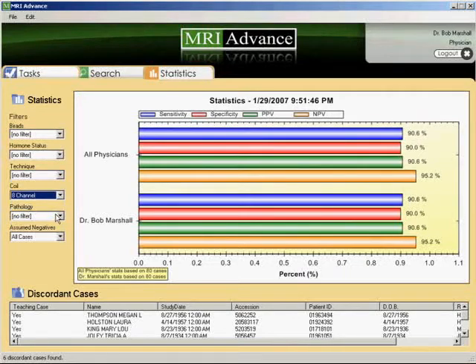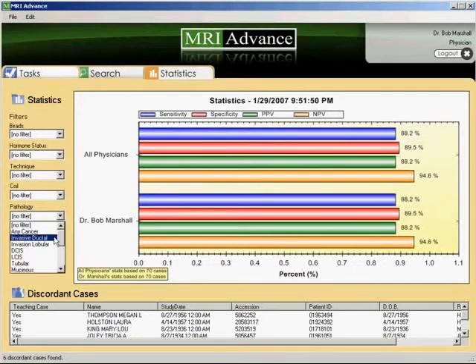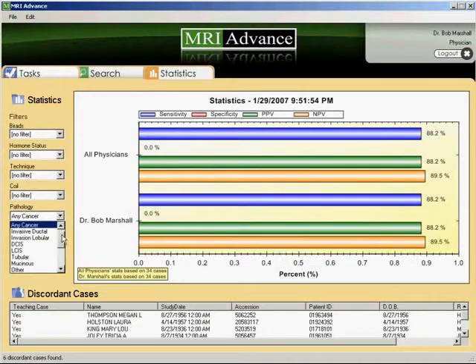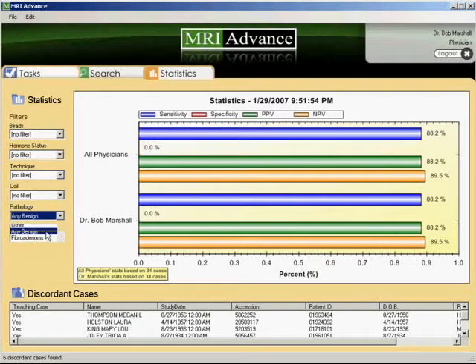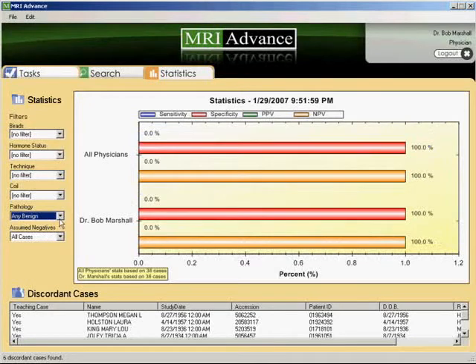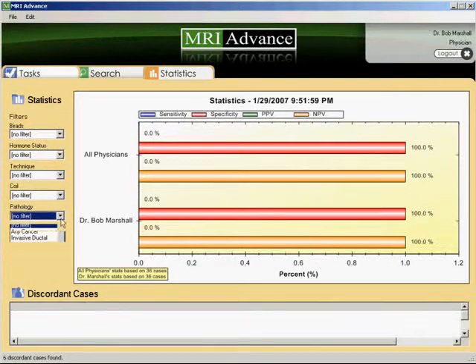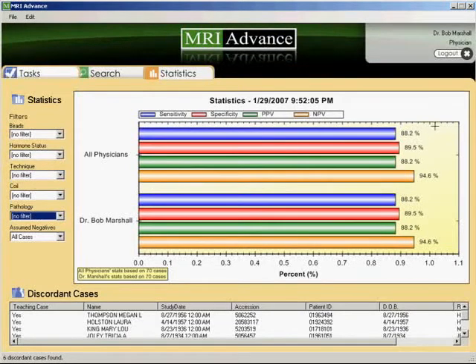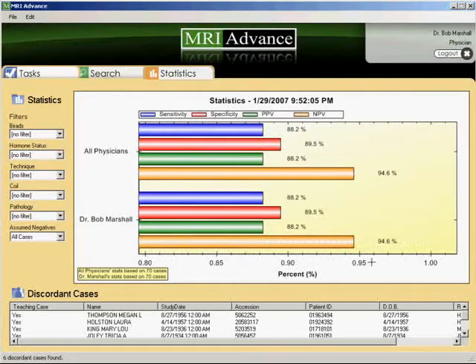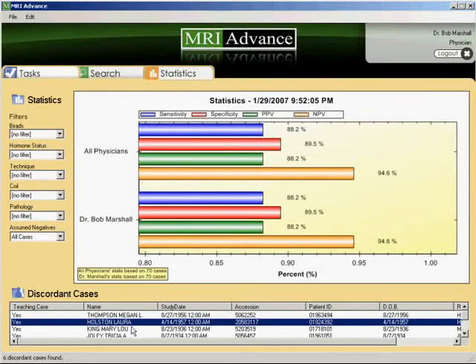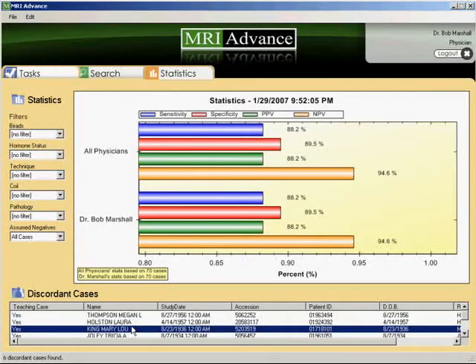Do you have better statistics with lobular cancer than invasive ductal cancer? A discordant case section has also been included, which will list any case that has pathology discordant with the initial BI-RADS code. For example, a BI-RADS code of 1, 2, or 3 subsequently shown to have cancer will be registered as a discordant case. Alternatively, a BI-RADS 4 or 5 interpretation subsequently shown to have benign pathology will also be registered as a discordant case.